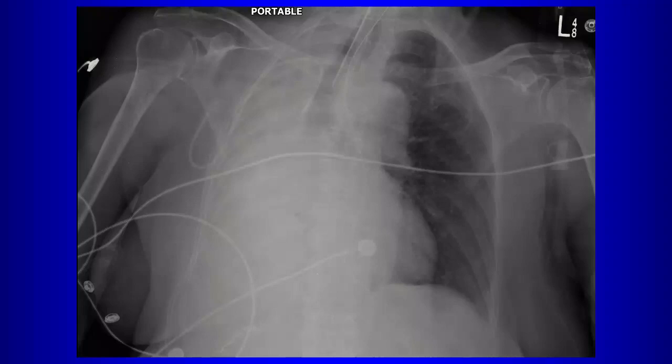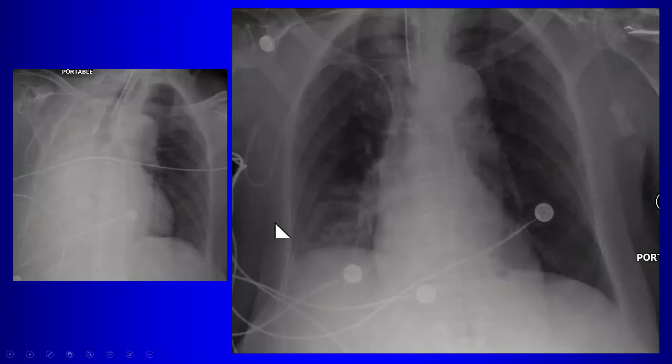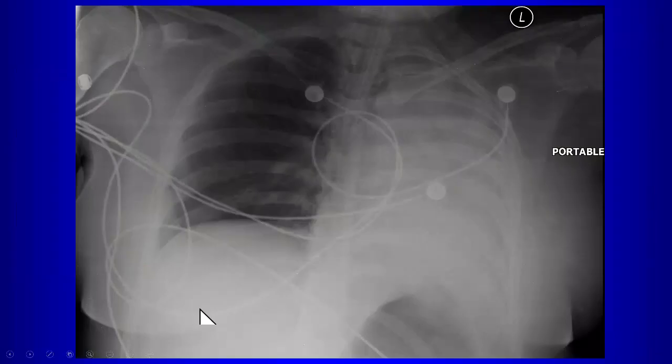So you would advise them to do what? Well, not necessarily suctioning. You start with suctioning first. The ET tube's already there. And then if they suck out the mucus plug, the lung expands pretty quickly, right? So when we have whiteout, you want to be able to differentiate the major causes because the treatment is going to be different.